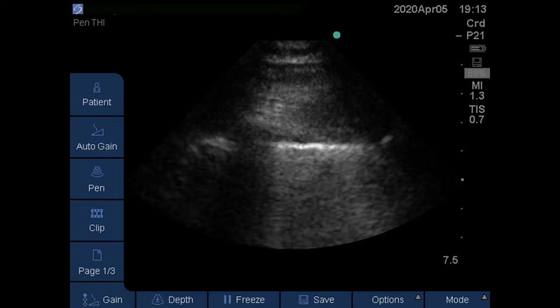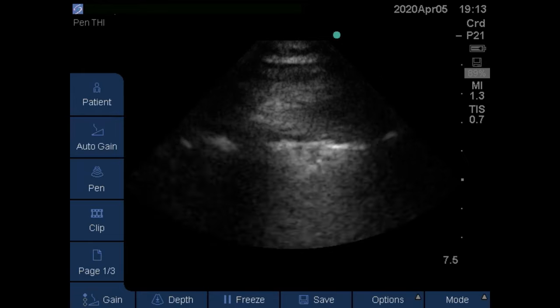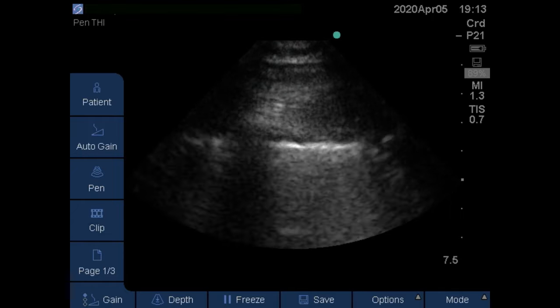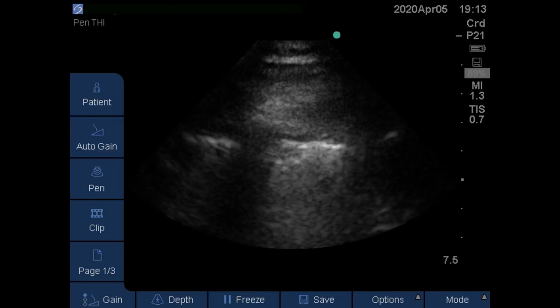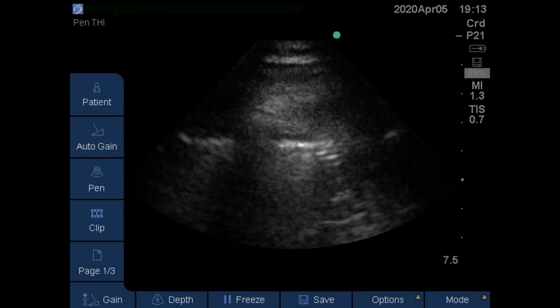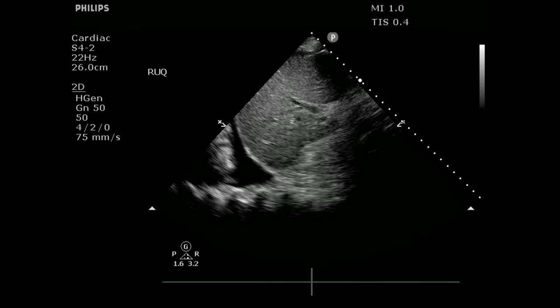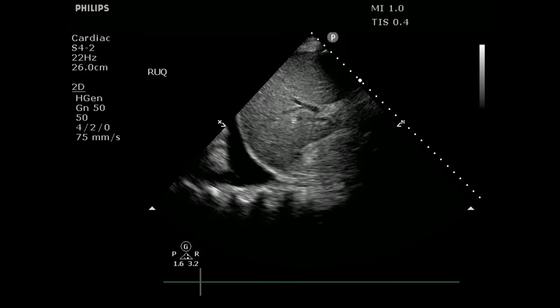In this situation, this is a patient that we had a long time ago with COVID, right? Basically you have a subpleural consolidation. So this shredded up pleura, you can see it between the two rib shadows where you have just a slight consolidation along that line, and that pleura just looks a little irregular. And that is followed up with the final pattern, which is basically the effusion, right? That's what we talked about last week, where we put things in that pleural space that are going to separate that lung from the diaphragm or from the posterior thoracic wall.